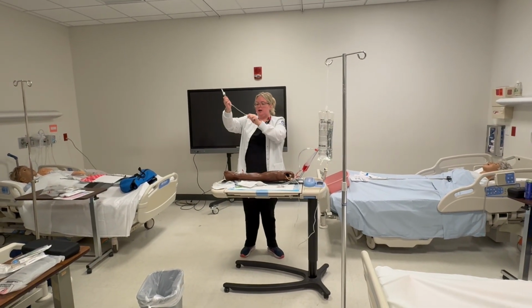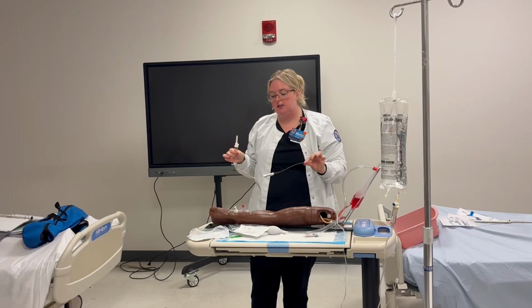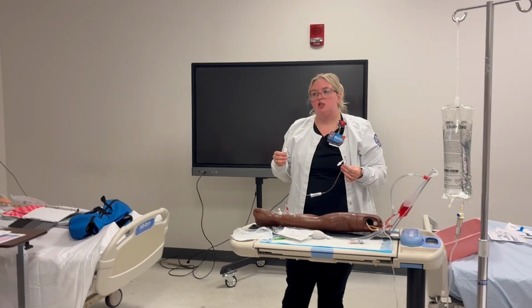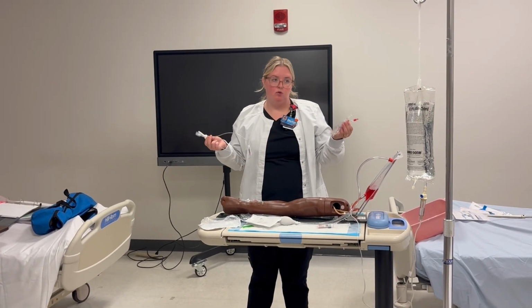I took tubing out of a package. I'm going to clamp it. This secondary, there's not much room for medication to flow out. If you spike this, and your medication starts flowing, you're gonna have to start over, because you have no idea how much came out, and your patient needs the full dose.